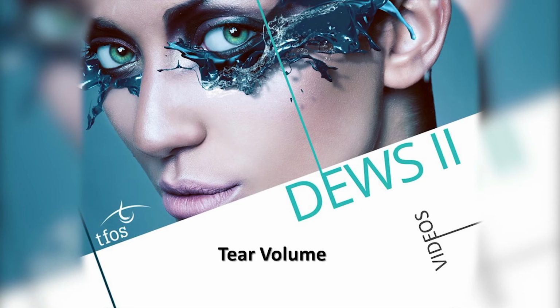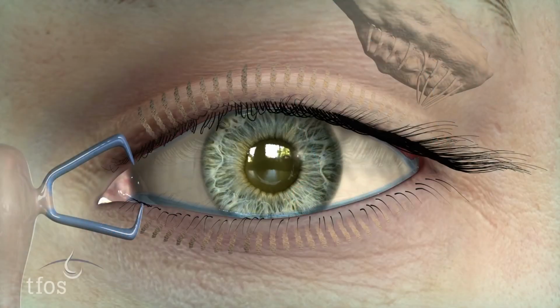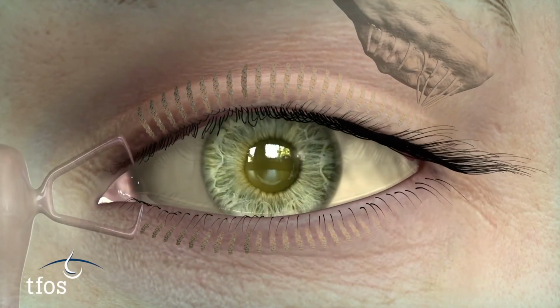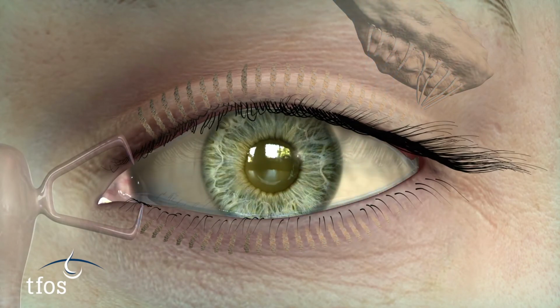Tear meniscus height measurement provides an indication of aqueous tear volume, as most of the tears reside in the menisci along the lid margins. The tears in the meniscus are spread over the ocular surface with each blink. They emerge from the lacrimal glands at the temporal aspect and progress in a nasal direction towards the puncta to drain through the nasal lacrimal canal.